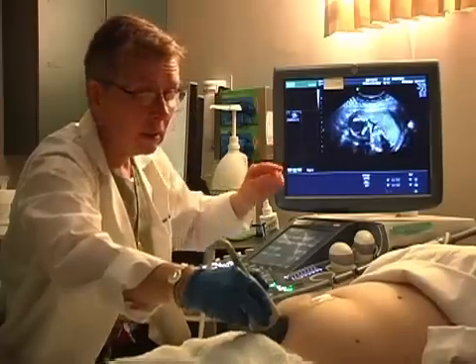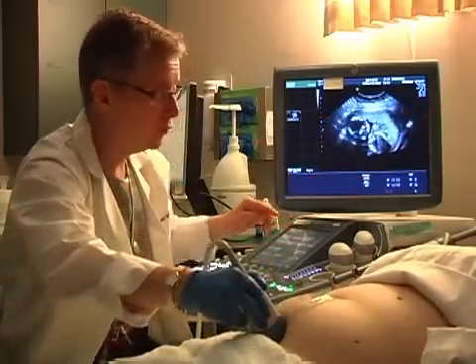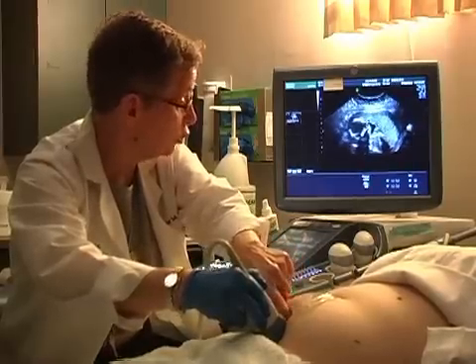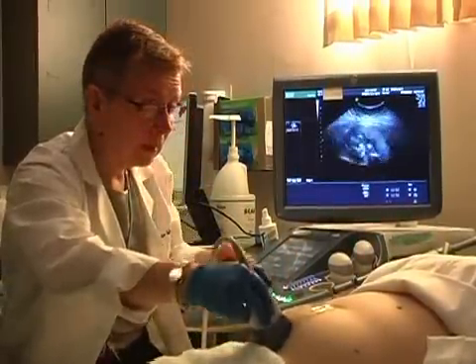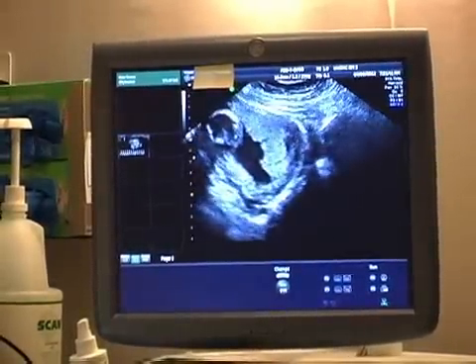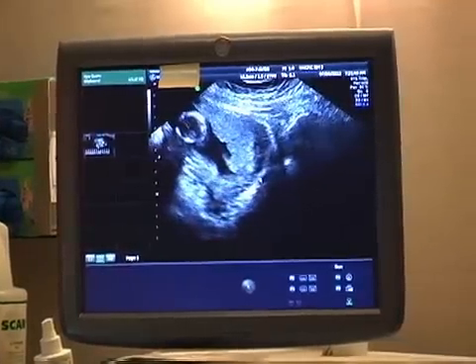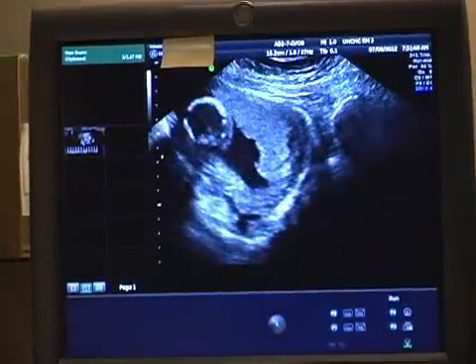When I go up and down, that ridge or marker is up toward your head, so that the left side of the screen is toward your head, and the right side of the screen is toward your feet. When I look down over the cervix, and I'm going to adjust this up a little bit, you can see I'm in the midline. This is about a 19-week pregnancy, and you can see that over the cervix, I don't see a presenting part.